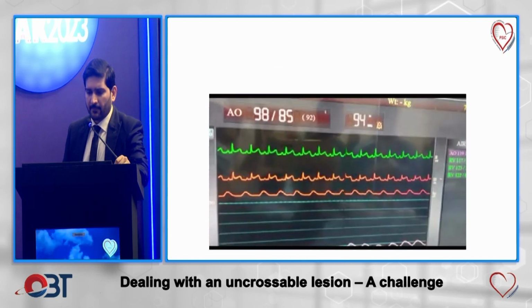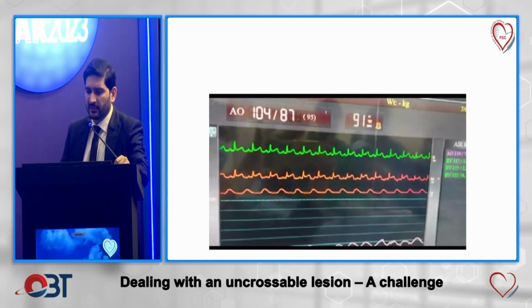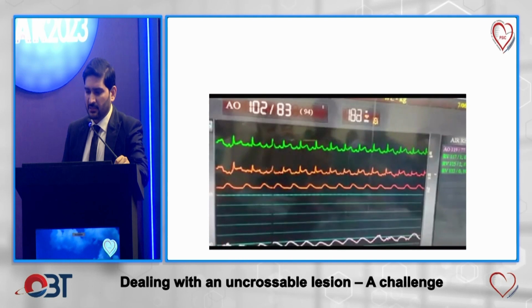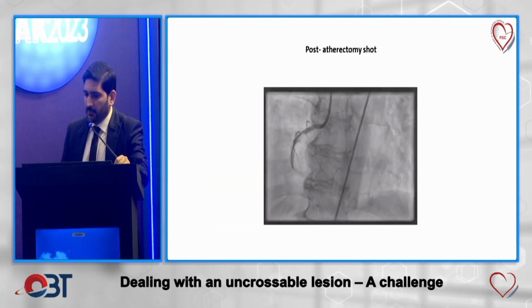This is the demonstration of the ST segment elevation and various degrees of block with each rota run. This is the post atherectomy shot.